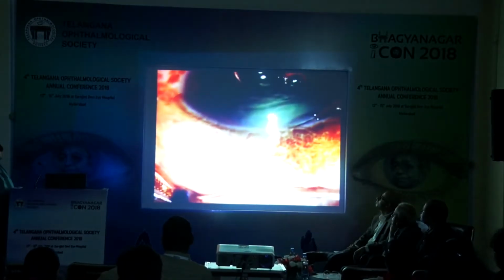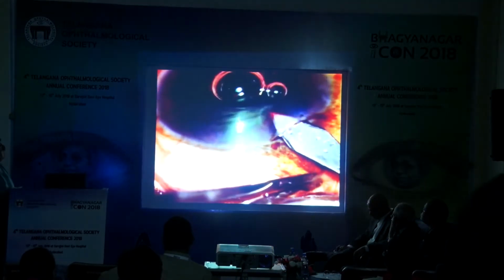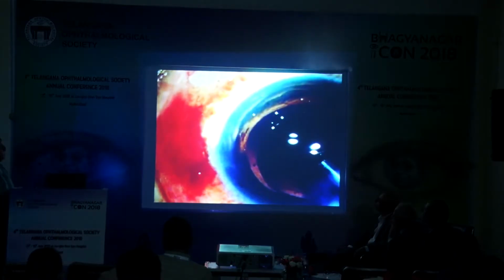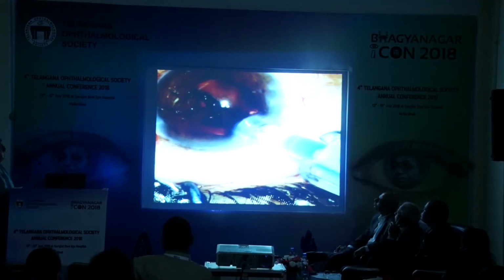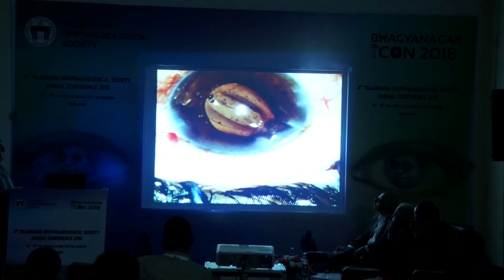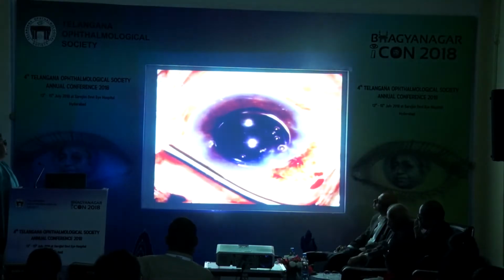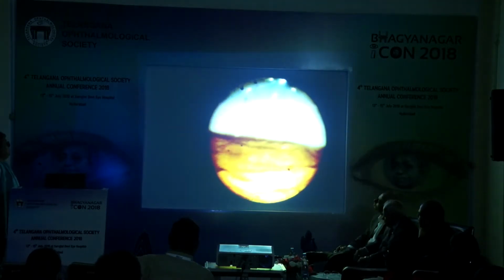We prefer a clear corneal incision for ease of access and its self-sealing properties. The same incision is typically used for both phacoemulsification and endocycloplasty. After phaco is completed and the IOL is in the bag, we fill up the anterior chamber with a cohesive viscosurgical device and introduce the endoscope in the AC to visualize the angle.